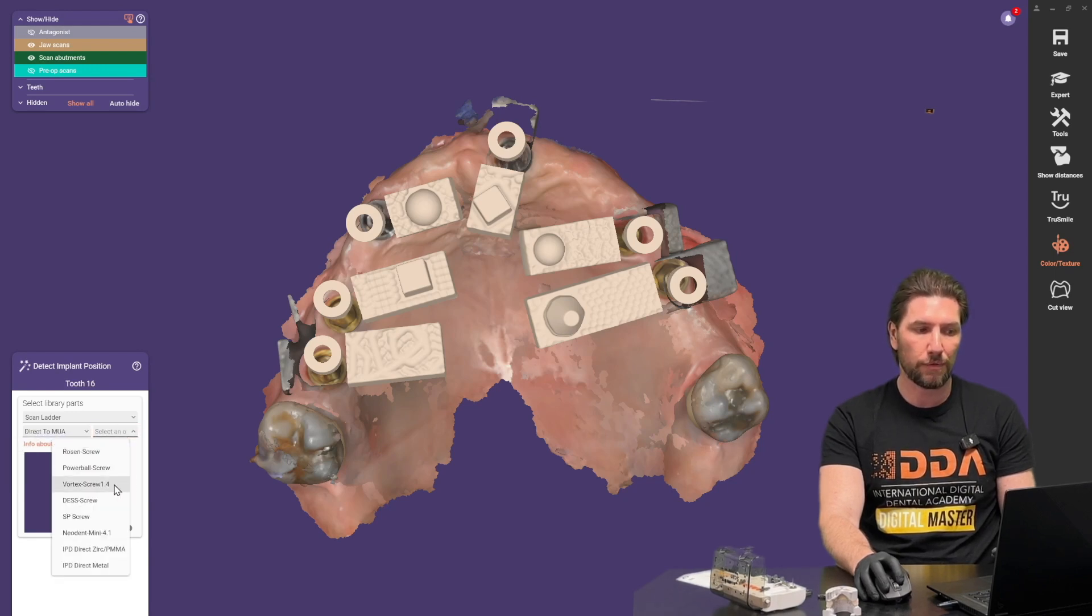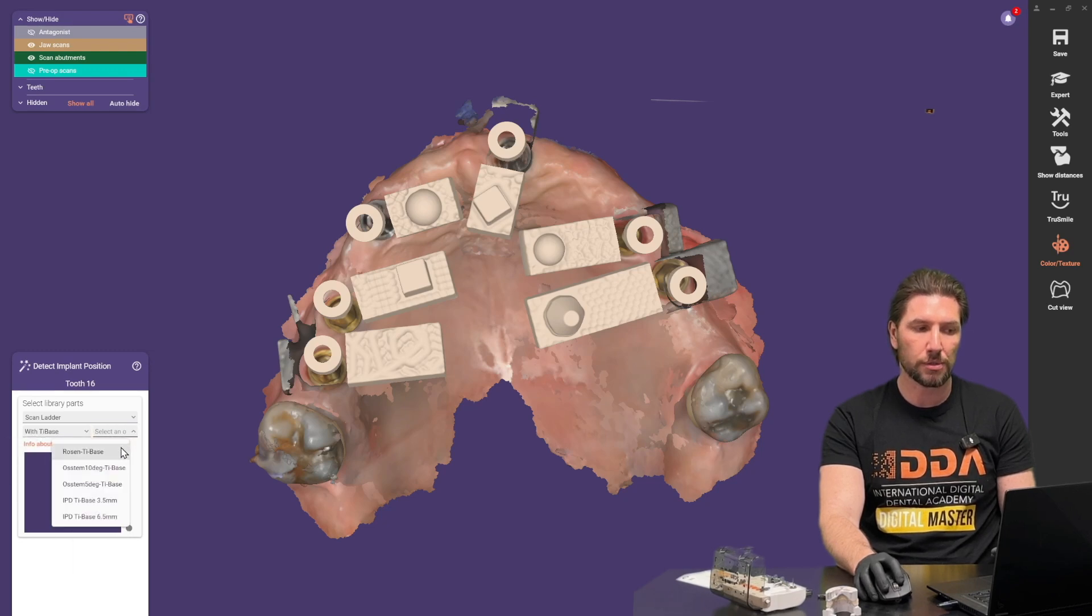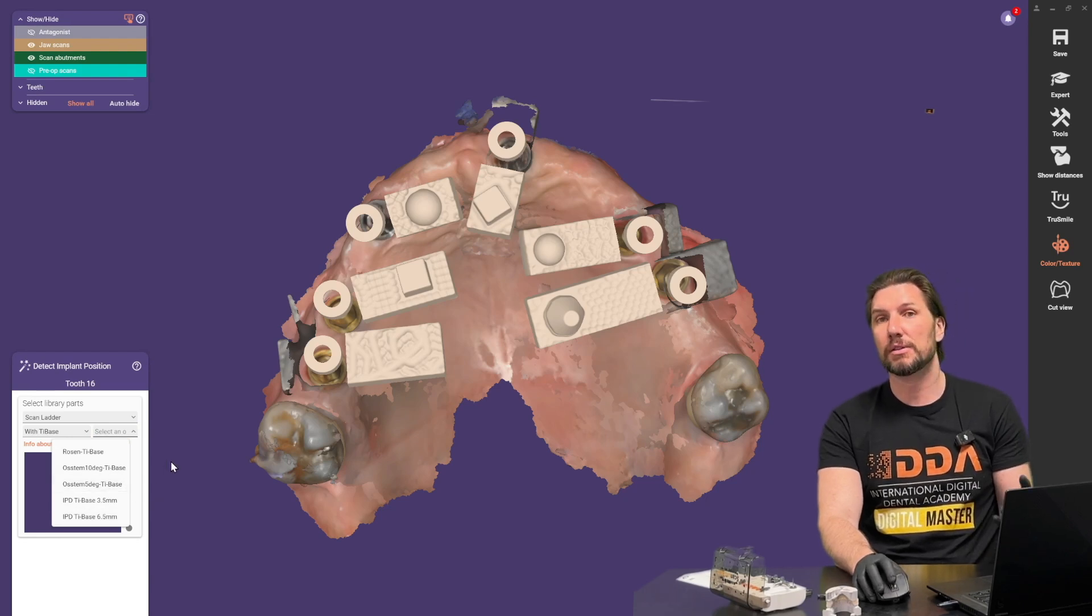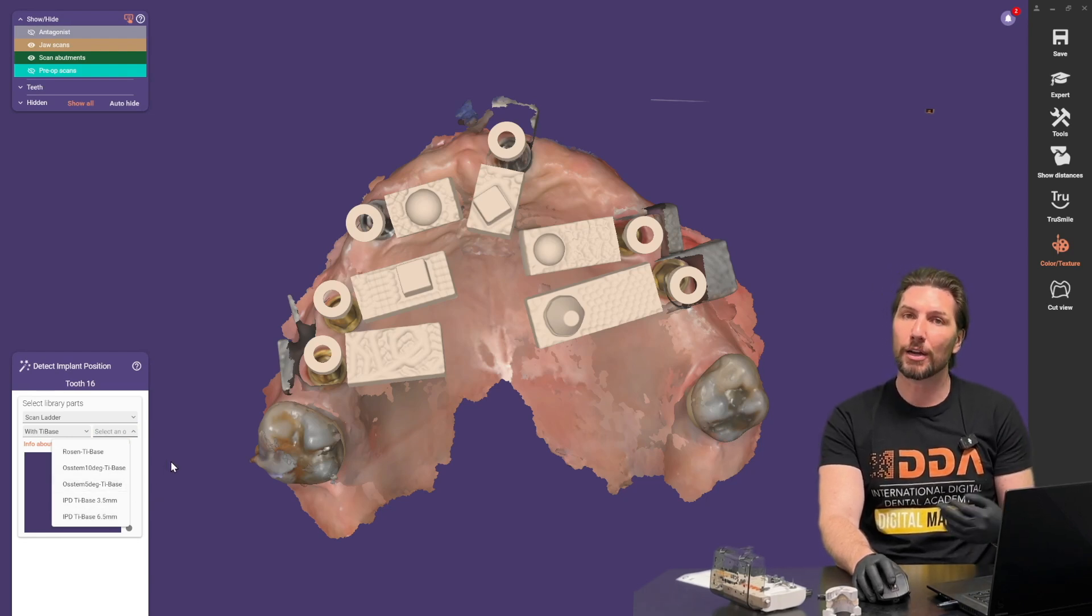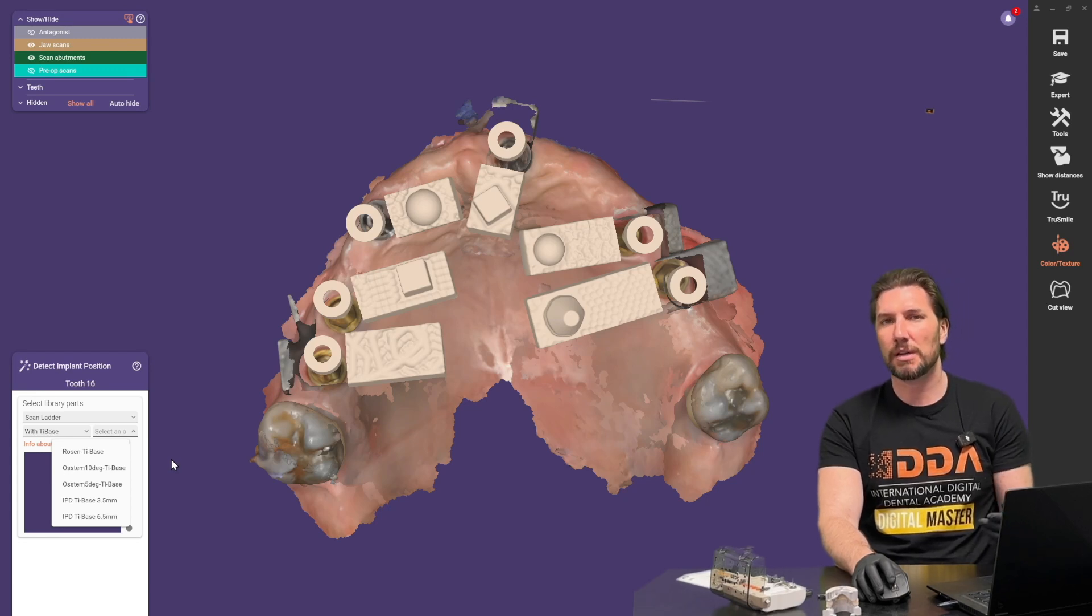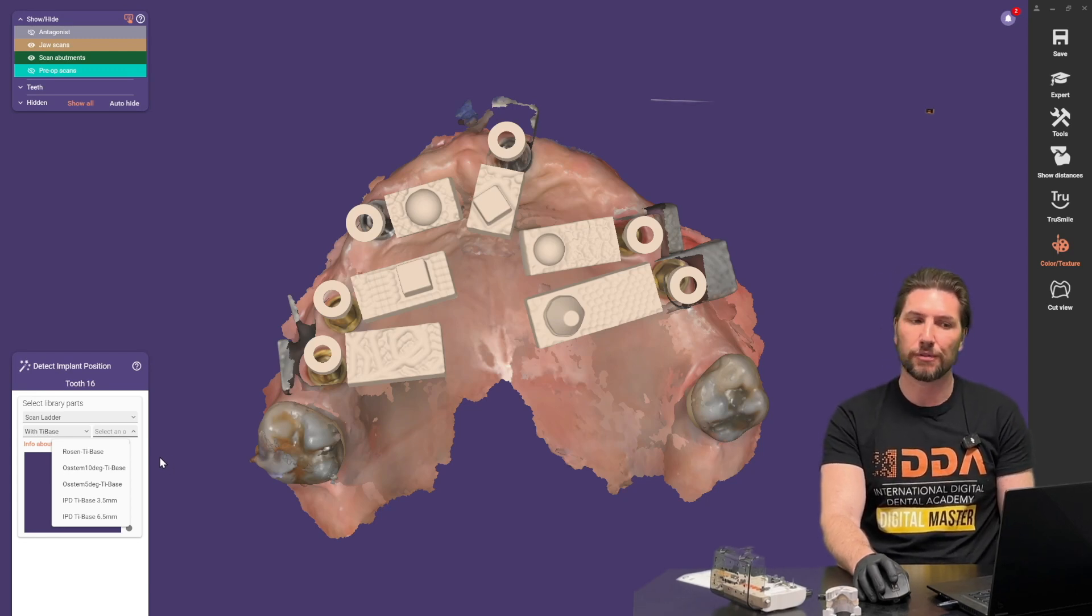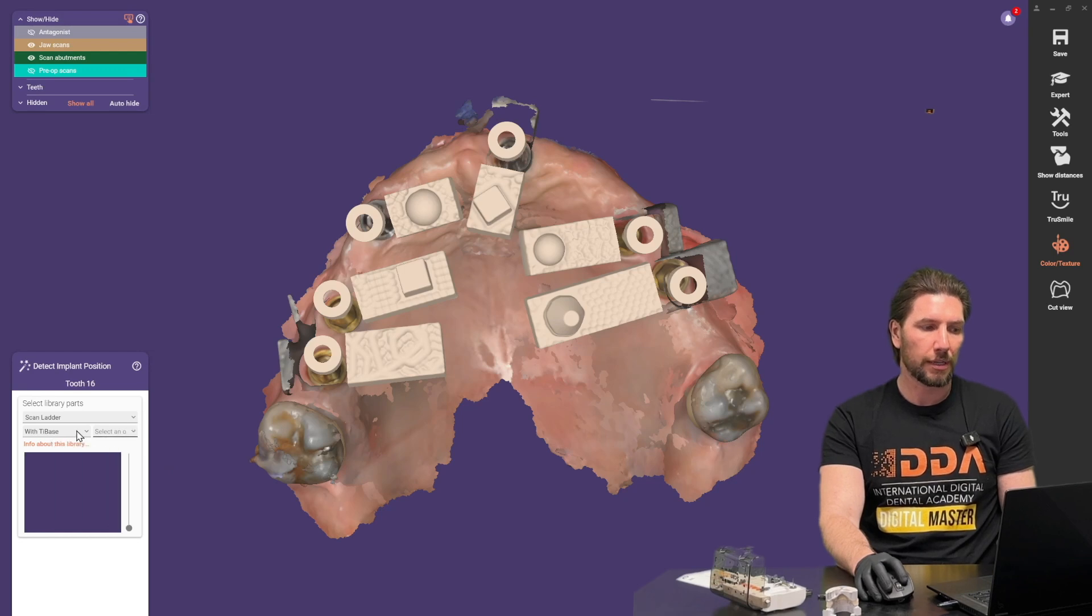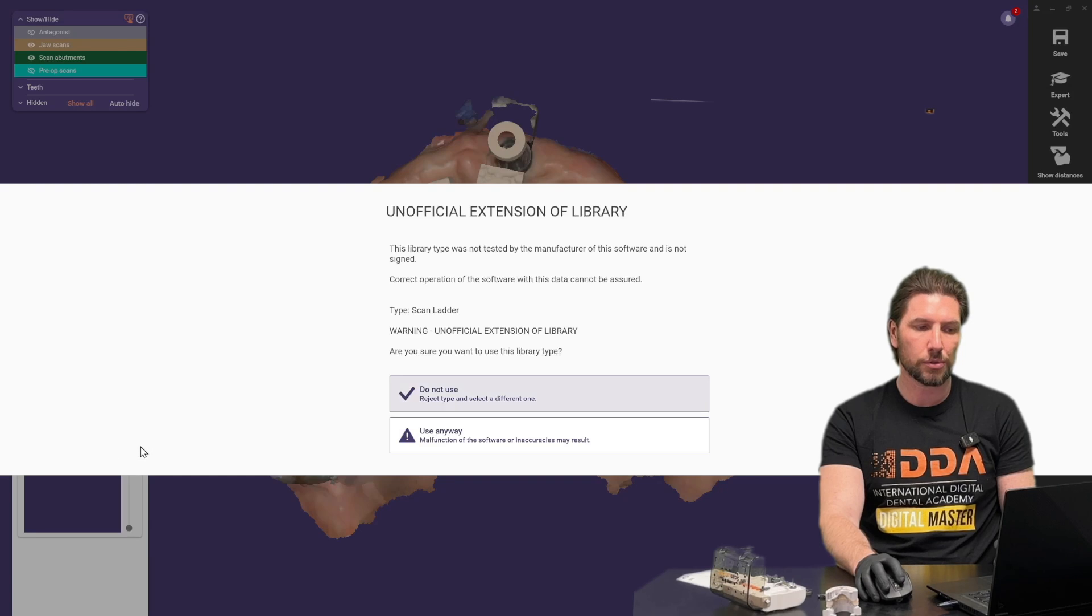For example we have the Rosen, Powerball, Vortex, DES, anything up to the IPD screws or you have different options for the tie bases and we have these options here. Keep in mind this list is open so if you want to add more to this library if there's a specific tie base you can send us that library we can integrate it for you. But for now we're just going to click on to direct to multi-unit and go with the conventional Rosen screw.